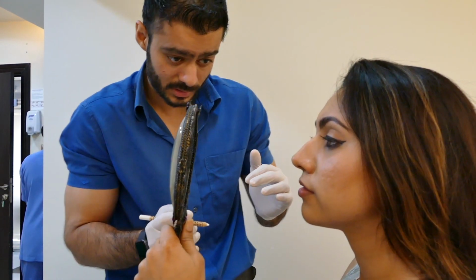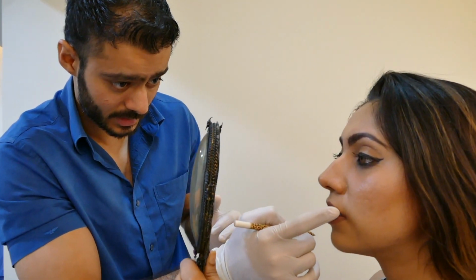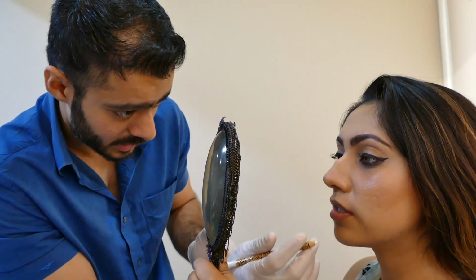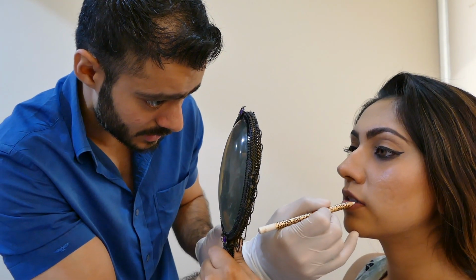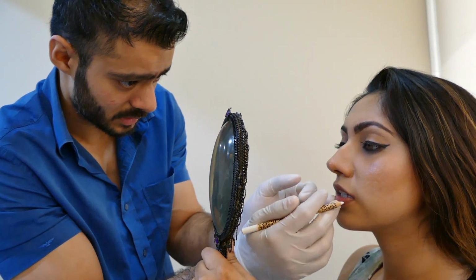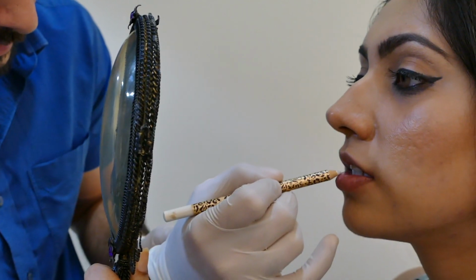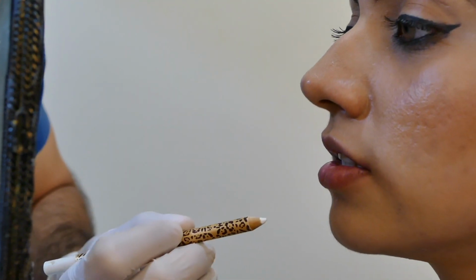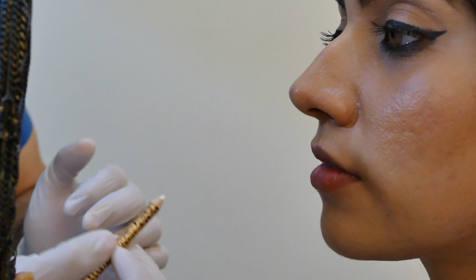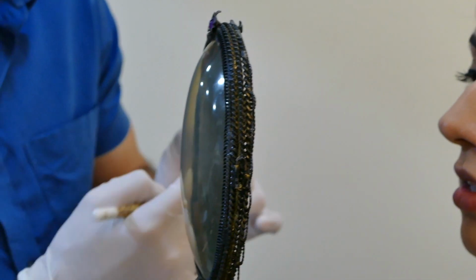First, I'm going to focus on the volume. So I'll fill a little more here and a little less here just to balance it out. I do appreciate the fact that this side is, of course there are no fillers here, so this side is thicker than this side. So first I'll inject this side and try and make it even. After that I'll start again. You get the point, right? First we'll even it out and then we'll start again.